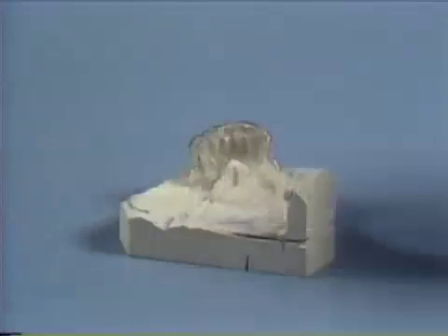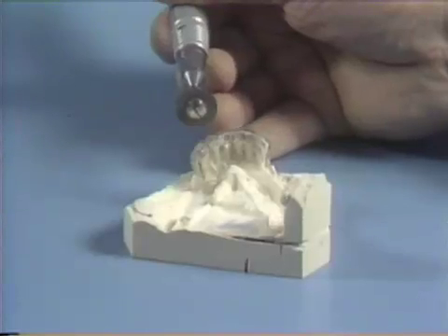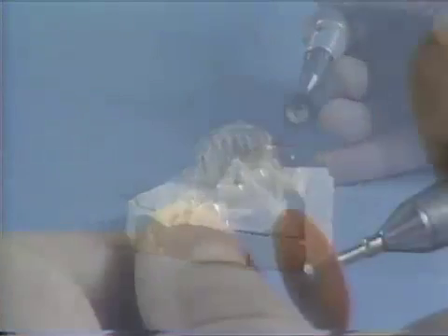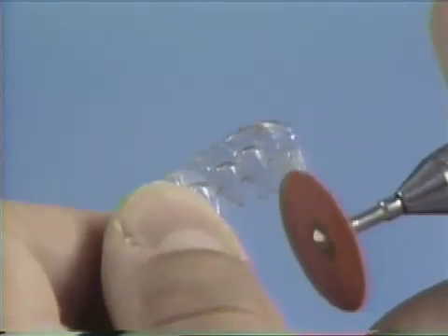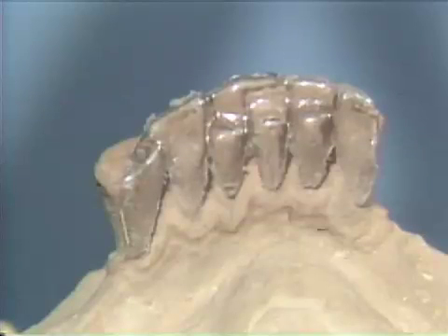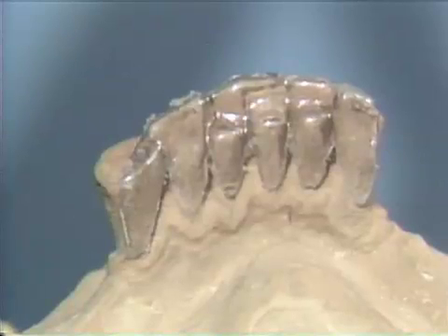Since the material will lock on the cast, thin separating discs are used to separate the matrix in half by cutting across the occlusal and incisal. This will allow proper access to the buccal half. The matrix is then trimmed with sand discs and burrs. Properly trimmed, the matrix will allow the use of an explorer to remove excess composite, resulting in a more predictable contour and minimizing finishing time. The matrix is checked for accuracy and verified on the cast.